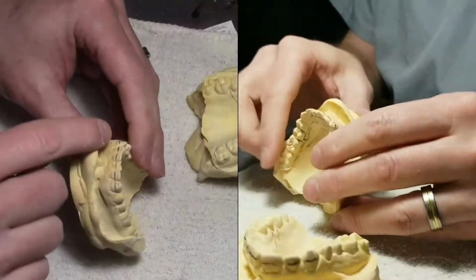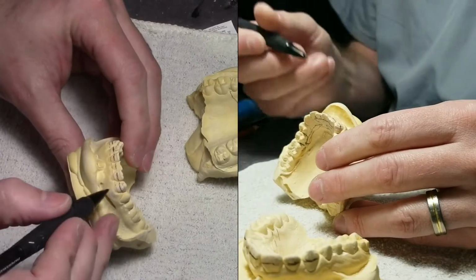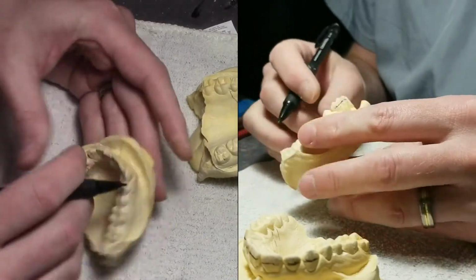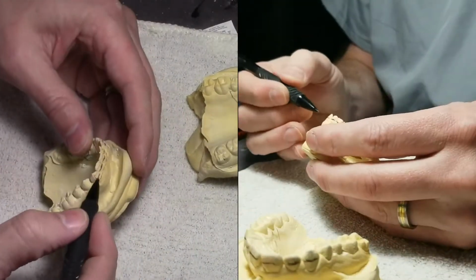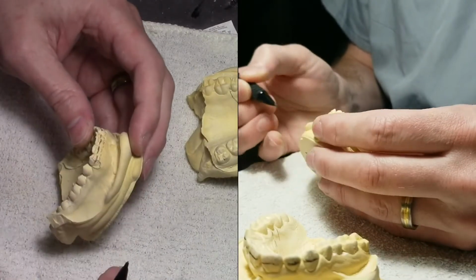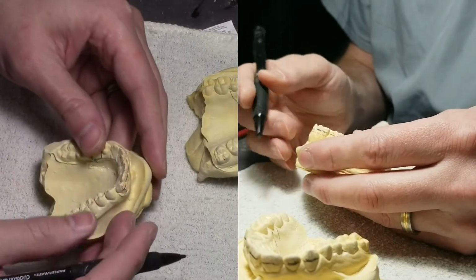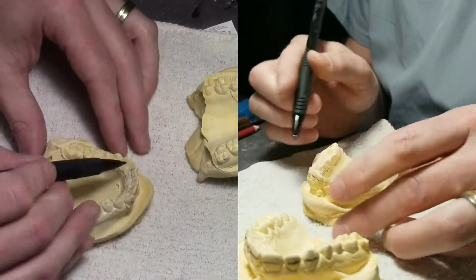So my red line means I do labial acrylic, and this just tells me a regular labial bow. What I was saying was I was going to reset this and my labial bow is going to go right there. I think with acrylic on it, it would be enough to pull that canine in a little bit. I've already marked the teeth.